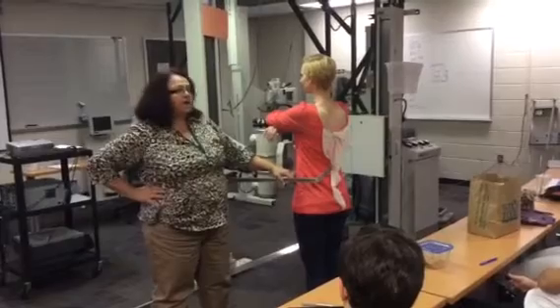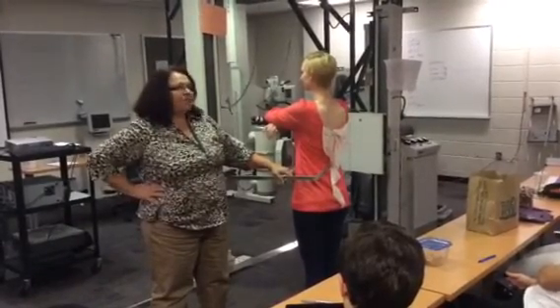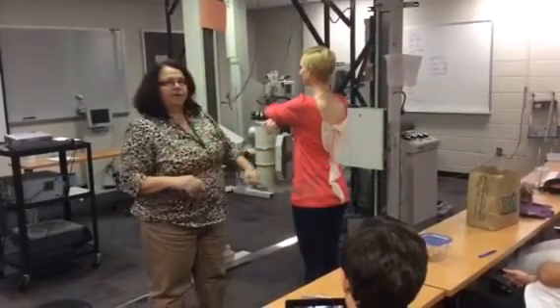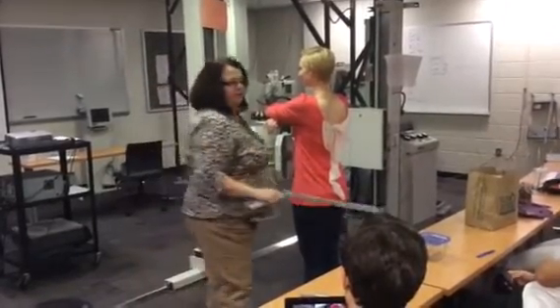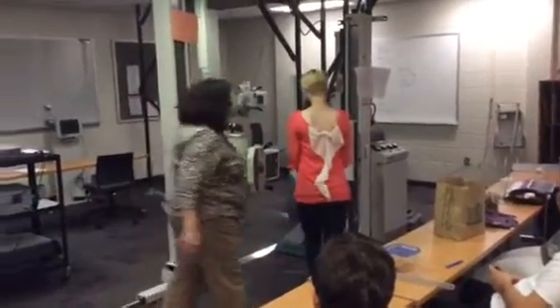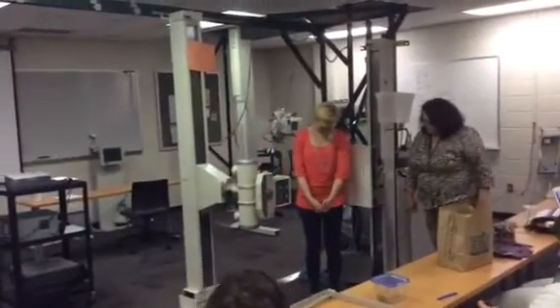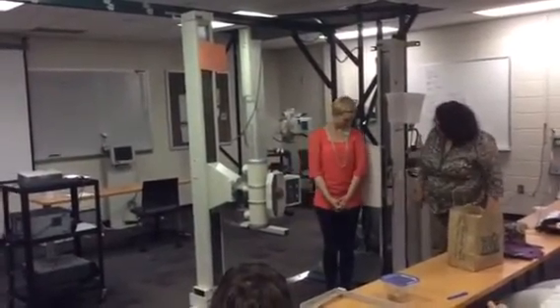Okay? And it doesn't matter which oblique you're doing. You don't have to measure on the side that you're going to be setting up. It doesn't matter. Okay? Now, step. What I want you to do is put your heels on that blue line. Step in to touch this.